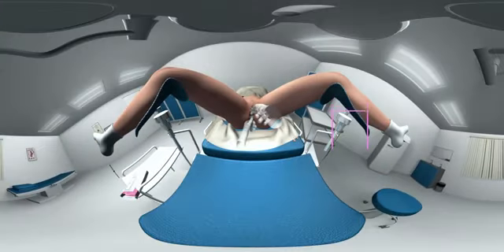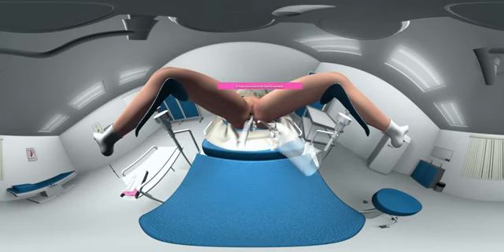Prior to insertion of EMILY, recommend the woman to undergo a per-vaginal examination. Clean the vulva before the uterine sounding. Gently move a uterine sound into the uterine cavity to the fundus to determine the direction of the cervical canal and the uterocervical length. Now let us see the simple steps involved in insertion of EMILY.